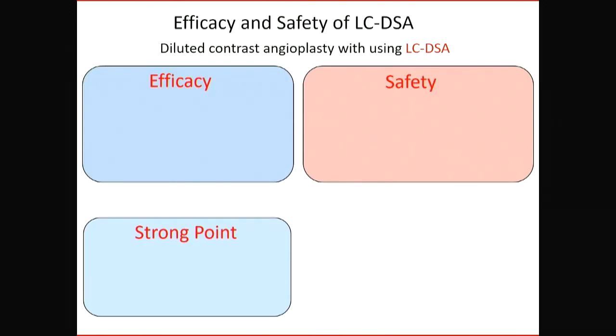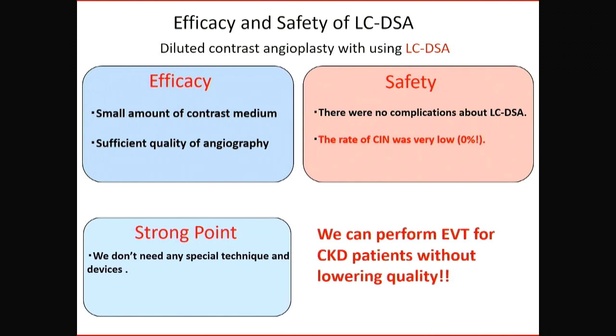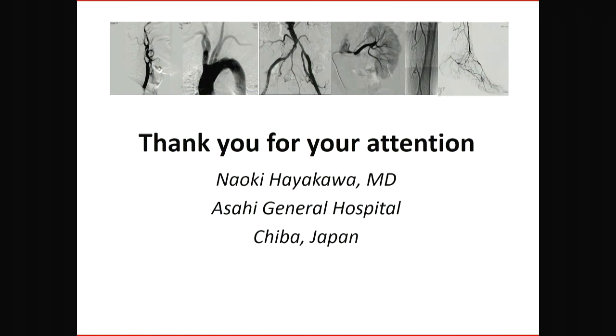So this is a key slide. We performed diluted contrast angioplasty. The efficacy is a small amount of contrast medium and sufficient quality of angiography. And for safety, there were no complications, and the CIN rate was very low. And the strong point is we don't need any special technique or devices. So we can perform EVT for CKD patients without lowering quality. So this is my conclusion. We experienced a very tough case using diluted contrast angiography, and LC-DSA has the possibility of being useful for treating CKD patients. Thank you for your kind attention.